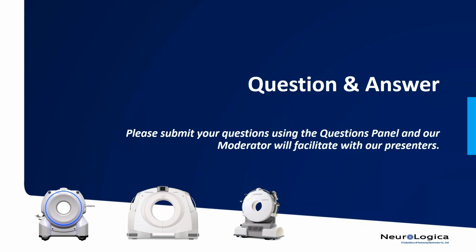Okay, there's a question. What about the use of ICT in brain surgery according to different patient positioning? For example, park bench, prone, or semi-sitting? Yeah. Semi-sitting is a little bit of a problem because you're limited by the bore. I mean, that really depends on how much sitting, what angle. Park bench is not a problem at all. Even prone, posterior fossa tumors, not a problem at all, because you can use your regular OR table, the scanner slides just over.